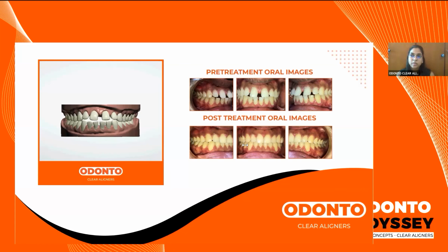Once you have done proximal reduction and broken the contact, you will have sharp line angles which form because you have run your burr or your strip straight through it. So you need to use a polishing strip and run it across, just smoothing down the contacts which are there.